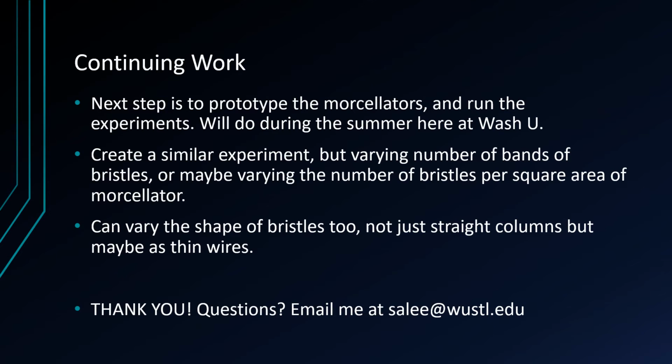Another variation of the experiment could be to work with different shapes of bristles, not just straight columns like a pipe cleaner, but maybe as thin wires that'll kind of serve as cheese cutters to carve out the clot, which may perform better.